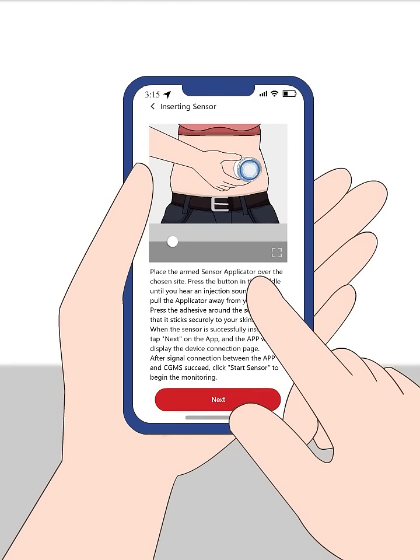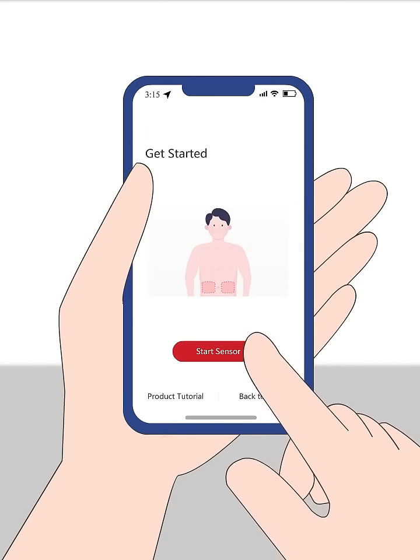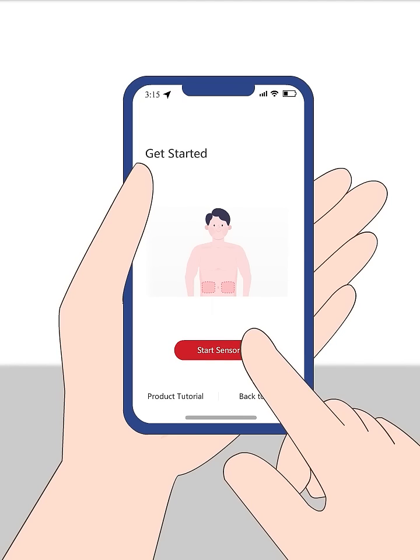After the device is implanted successfully, click Next in the app and the app will display that the device is being connected. After the CGMS signal is connected to the app, click Start to begin the monitoring. Also link to the background and click Start to begin the monitoring.